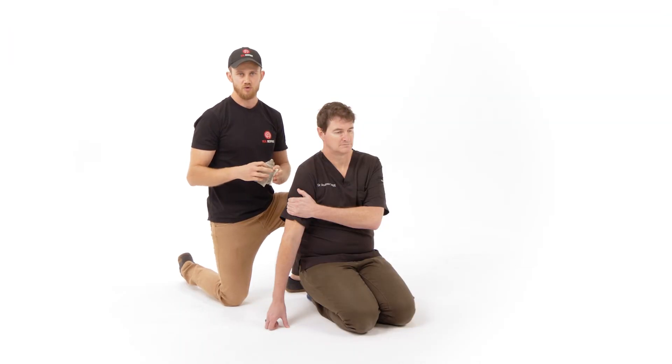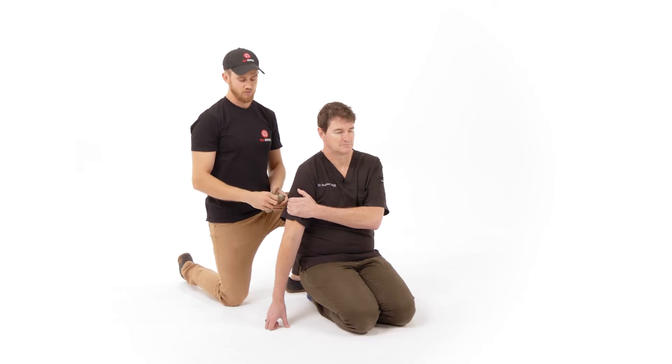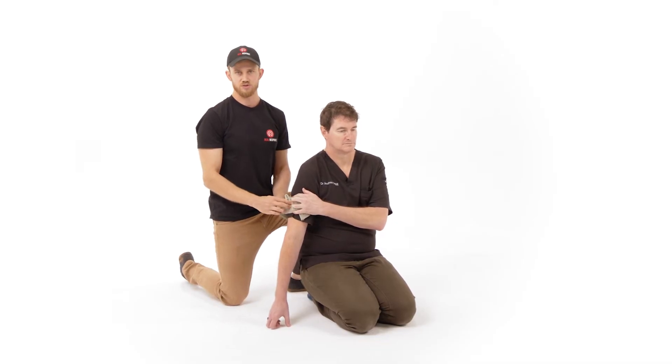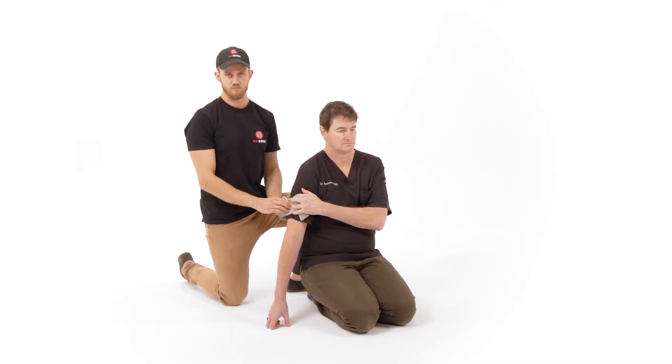Take out your Israeli bandage or emergency bandage and replace their hand with direct pressure from the dressing component of the bandage, asking the patient to continue to apply pressure over the dressing.